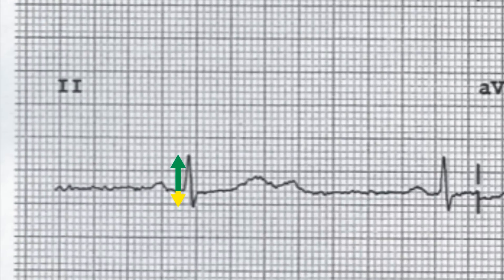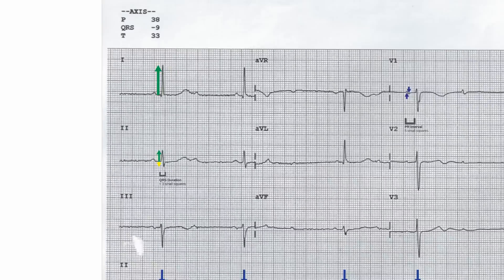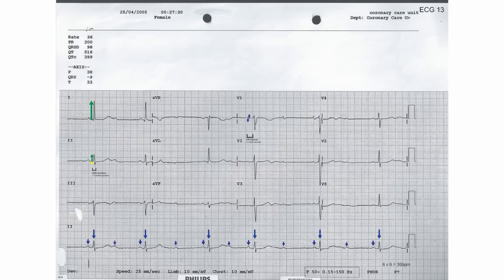The QRS complexes are normal in duration. There are no visible Q waves. There is no great abnormality of the ST segments or T waves.